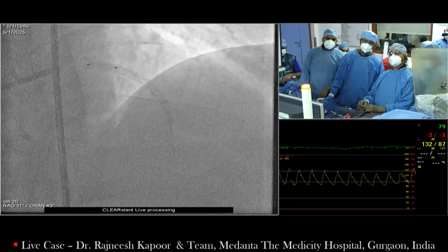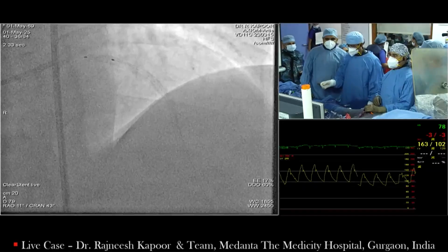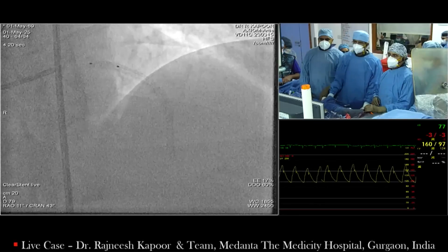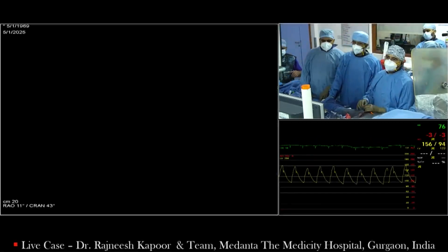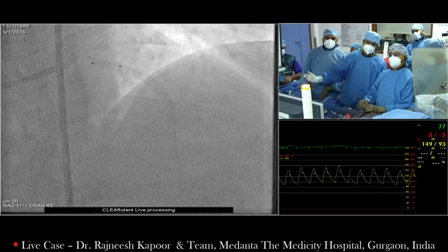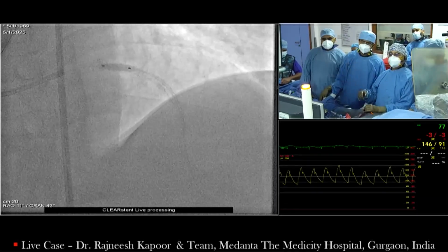I think in India, at least, and in Pakistan as well, Bashir, you know, there are probably about 15 drug-eluting balloons. Yeah, they're different. There are multiple companies, and because we have a lot of diffuse disease, we use it quite commonly. Right now we have only 1 approved from Boston and 2 are in clinical trials. 1 is from India, the Magic Touch balloon in our center. And then the other one is Cordis, which is solution for small vessel disease. Down.